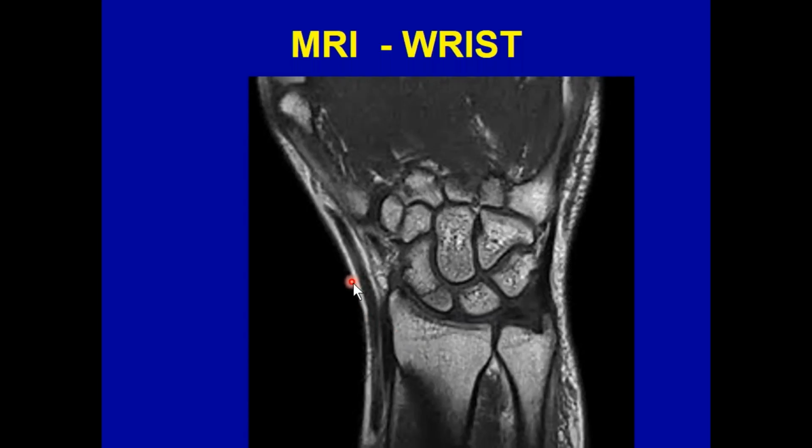The white area where the laser pointer is abutting now is the soft tissue of the hand. This is a tendinous structure, and there are tendinous structures on the radial side as well as on the medial side. So there's just a lot more anatomy that we can visualize. We can see superficial structures, tendons, the muscles of the fingers, and obviously osseous components, and certainly we can see the radius and the ulna. There's a lot more information that the radiologist is responsible for, but we can also give a more precise diagnosis if the MRI was done.